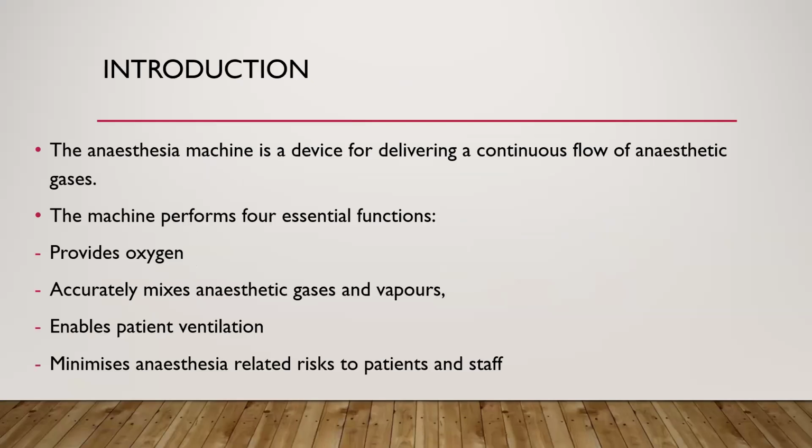Let's go into our study. I'm going to send the 6 questions on the group. Please try and answer them, and I'm sure that by the end of the tutorial, we should be able to answer them correctly. As an anesthetist, the anesthesia machine is our workstation, and we should be familiar with it.